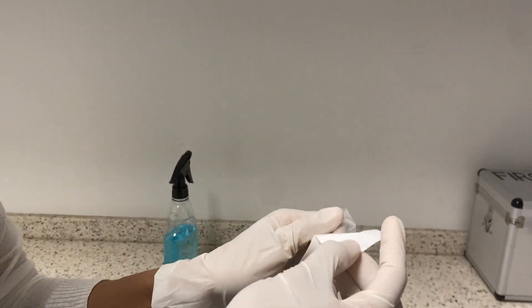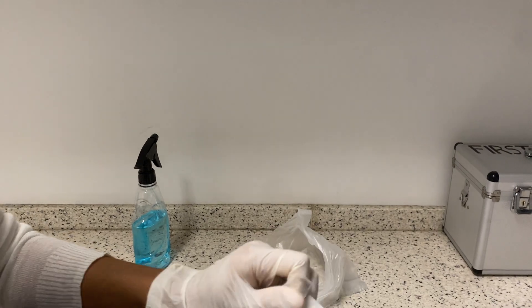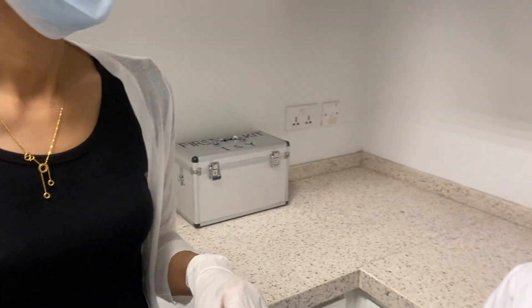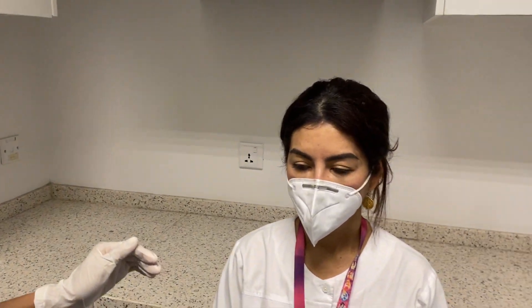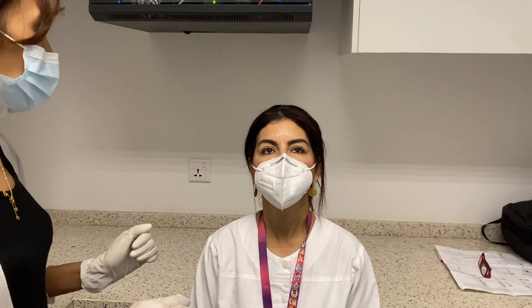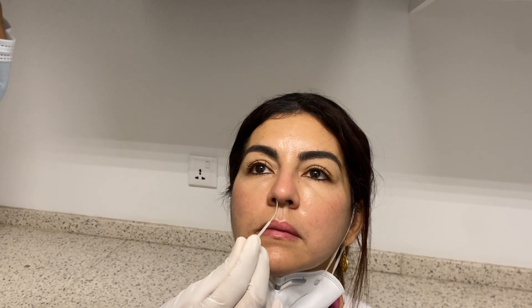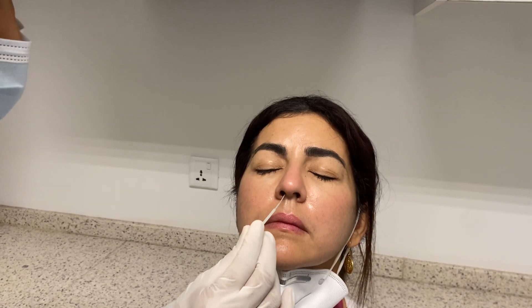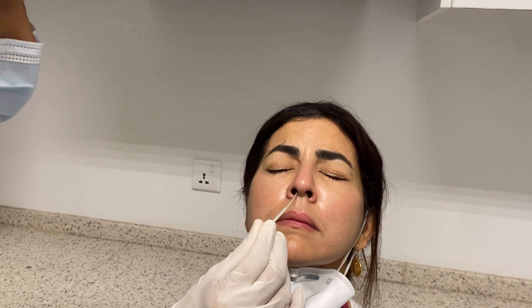Open the swab and ask the person to tilt their head slightly backwards. Insert the swab into each nostril and rotate five times: one, two, three, four, five.